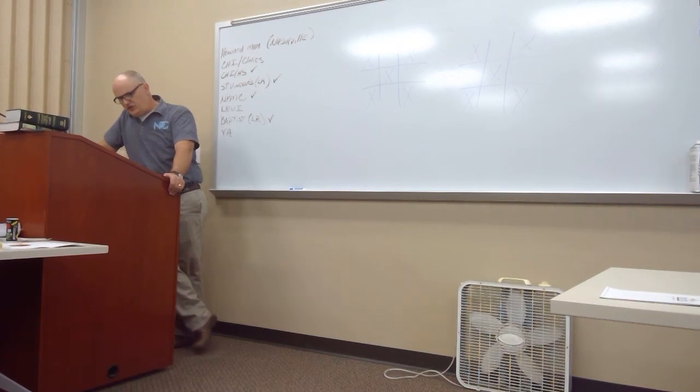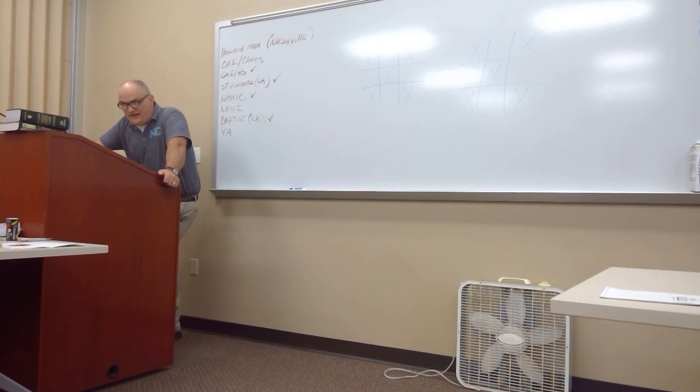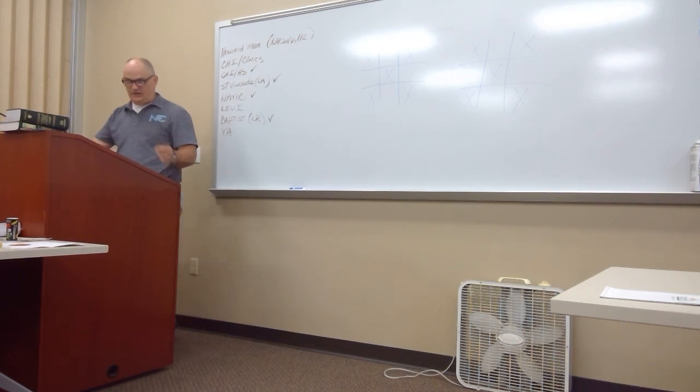It also states, if you'll skip a sentence, to ensure that oligoclonal bands are present as a result of neurologic inflammation, you have to do a CSF electrophoresis along with a serum electrophoresis. Next paragraph says the presence of 2 or more oligoclonal bands in the spinal fluid that are not present in serum, that's very important, you'll see that again, can be a valuable tool in the diagnosis of multiple sclerosis, particularly when accompanied by an increased IgG index.